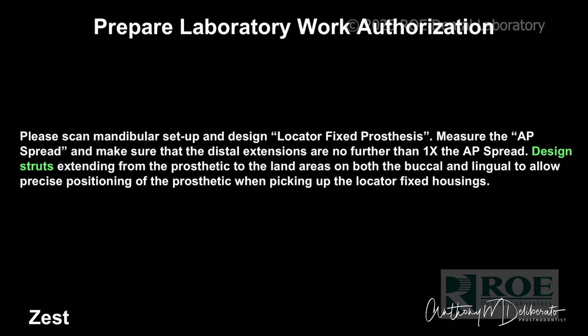Okay, and so the reason I go into so much detail, sometimes I think some people don't like as much detail, but the success of these cases is more dependent on all these little things in terms of case workup than just learning parts and pieces.